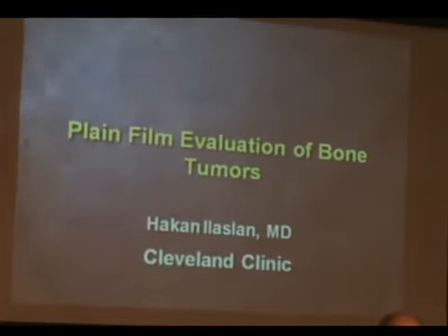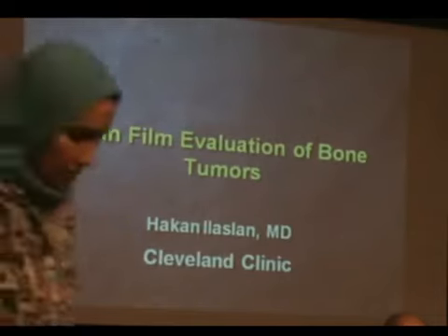So my first talk is on plain film evaluation of bone tumors. As you know, although more advanced imaging modalities are widespread, bone tumors are still best evaluated with radiographs, and I would like to talk about that in the next 45 minutes or so.